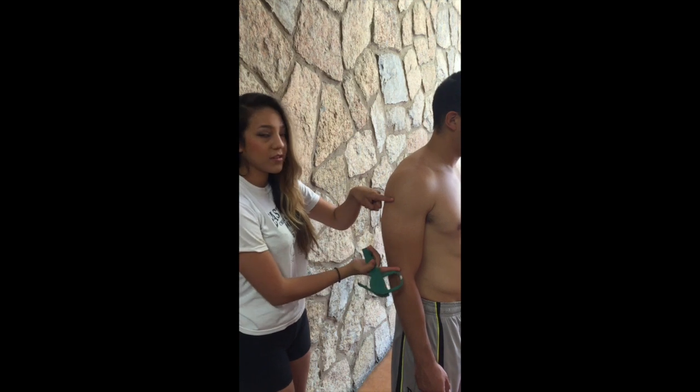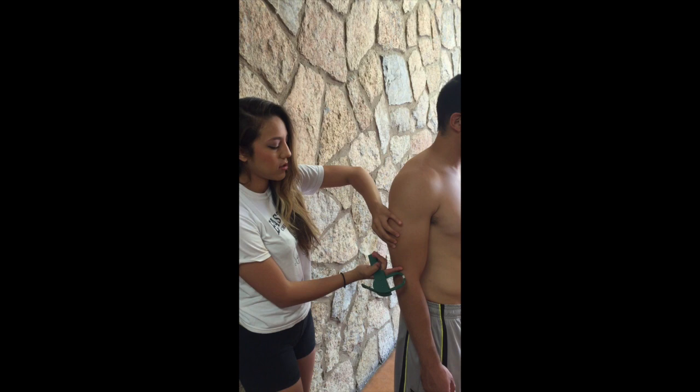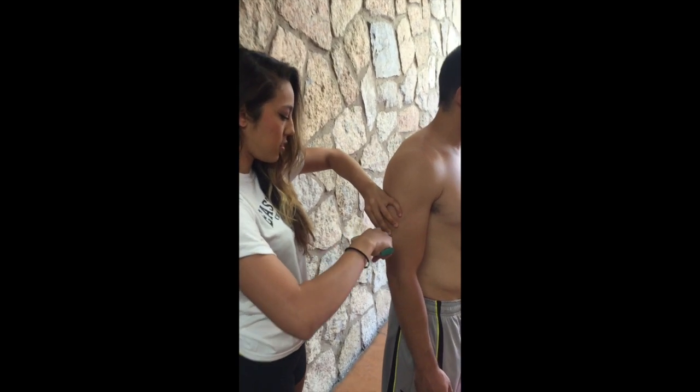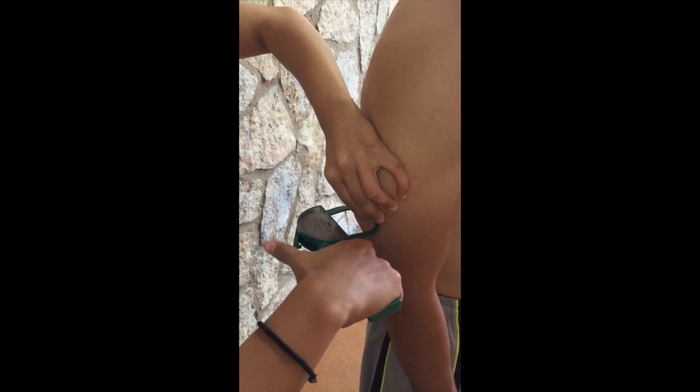Prior to taking the measurements on the tricep, the subject should have their arms freely relaxed by their side. The tricep is measured using a vertical fold on the posterior midline of the upper arm, halfway between the olecranon and the acromion processes.